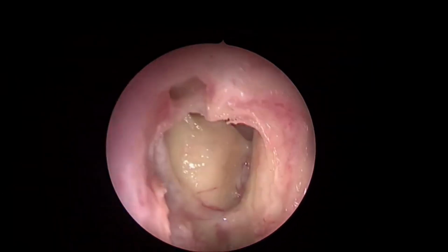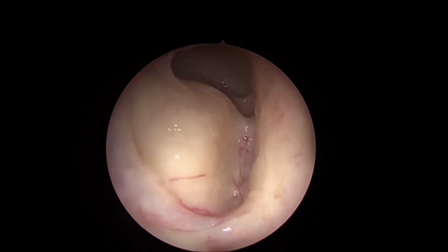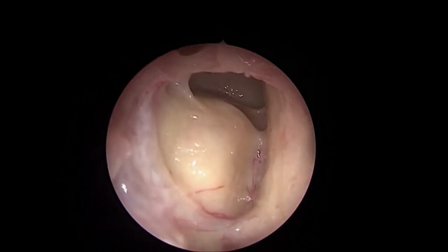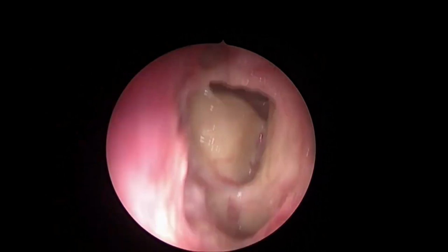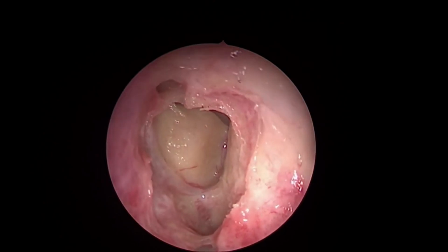Prabhakaran, anything to add on? We need your comments. Beautifully done. I think the only other thing is that we need to preserve as much mucosa as possible, because if we leave bare bone exposed, absolutely, then we get fibrosis. But I agree with what you said.